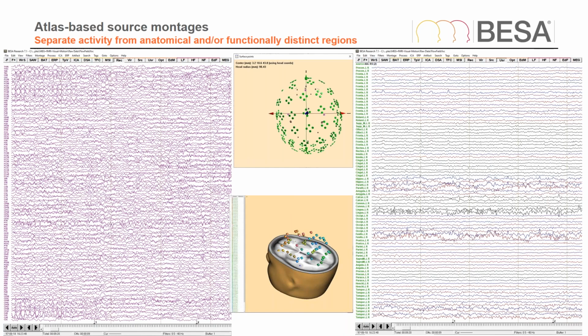And now if I use beamformer virtual sources instead of this, or just maybe a few beamformer virtual sources, instead of this large number of sources distributed over the brain, I should in theory have an advantage, because the beamformer spatial filter is already constructed in a way that excludes contributions from remote parts of the brain. Okay, and this is maybe enough theory for the moment. So I think now it's time to try the beamformer out in real life.